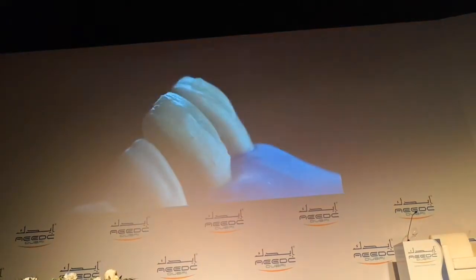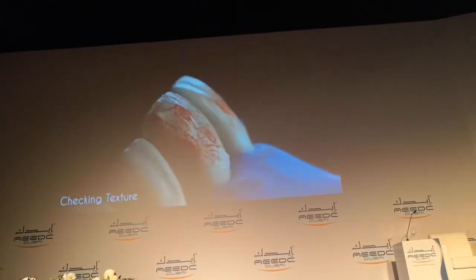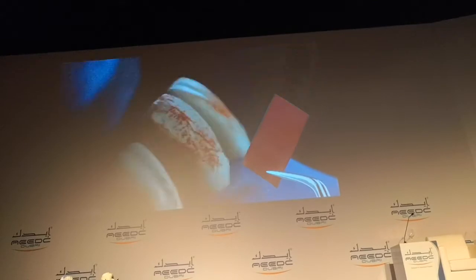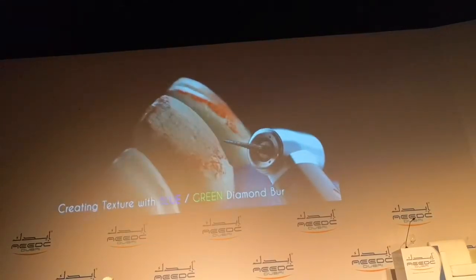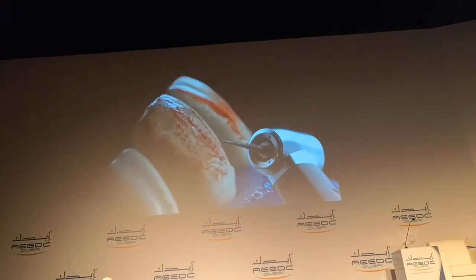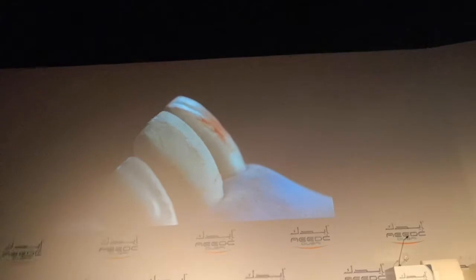And then after final curing you have a surface that you can give some texture. For that reason you can check the texture with the articulating paper and add some texture again, and then check it several times until you are satisfied with the shape. When you are happy with the shape you can go on to finishing and polishing. Because on this surface you create some scratches with the bur, and then you need to get rid of these scratches with the rubber instrument — which is possible with the Amelan or Shofu Diacomp rubber. A heavy rubber — first I need to finish instrumentation with the bur.